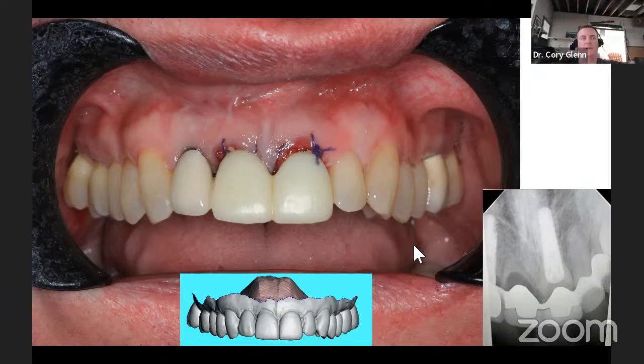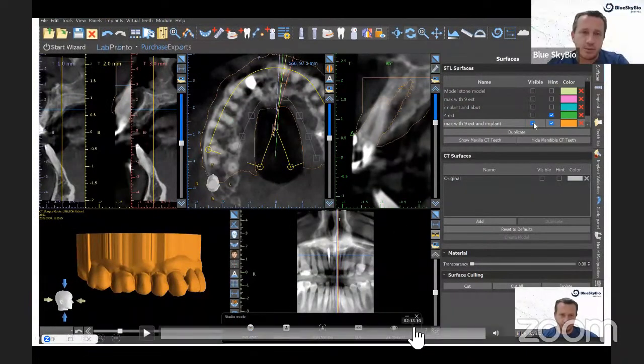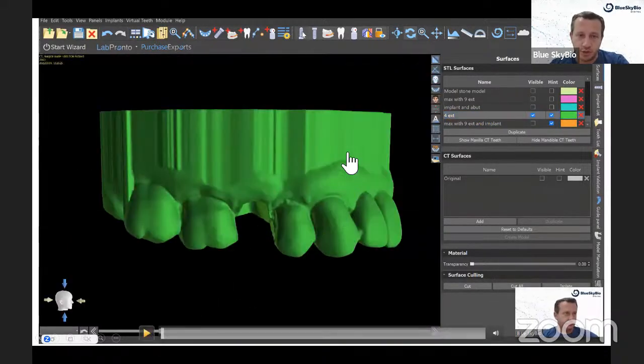It's really only once you've developed a surgical guide or added implants into the case that you're going to get dinged for an export. Design a denture, design ortho trays, the kind of stuff that you're physically fabricating within the program. That's what's going to be associated with the exports. But again, they're very reasonable, especially when you look at the cost of many of the other dental programs that are out there. Basically, the idea is that when you've generated something that you know you're going to use and apply to treating a patient, that's when there's a fee.